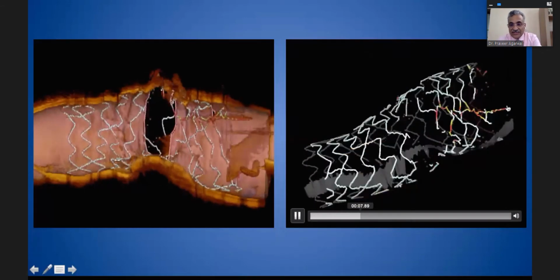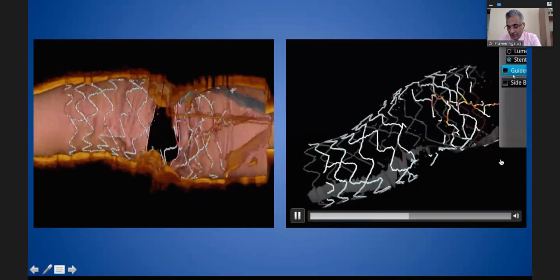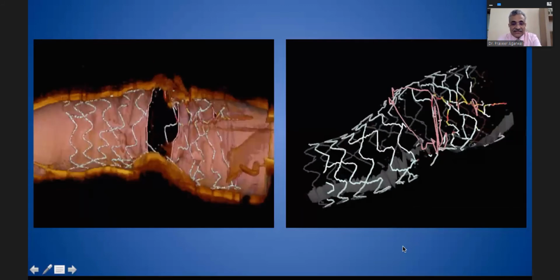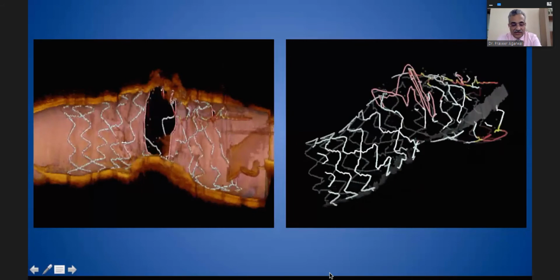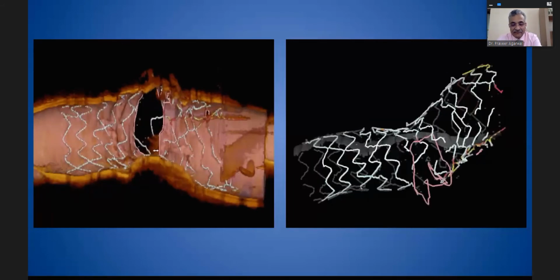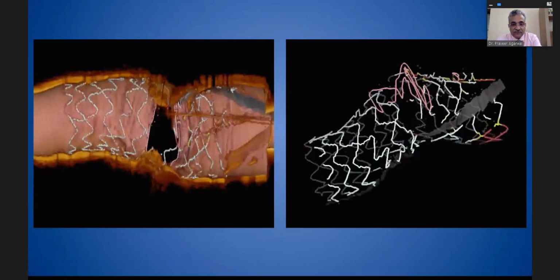We knew the proximal stent is not very well deployed. It's not apposed because the artery there is 5.7 and we have done only 5. But seeing this architectural damage to the stent, we did not dare to go up with the balloon again. And let me show you the last angiographic picture.